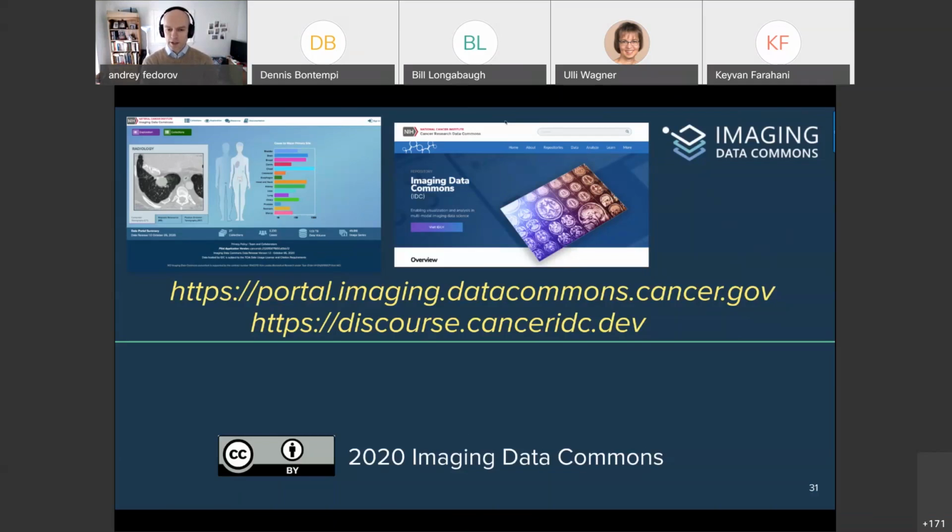Our current plan is to have a dual personality DICOM for the digital pathology and the whole slide microscopy. So essentially, we would have a file that would be recognized as a valid DICOM file and also at the same time as a valid OME TIFF file. I know that David Clooney is on the call right now, or he was.